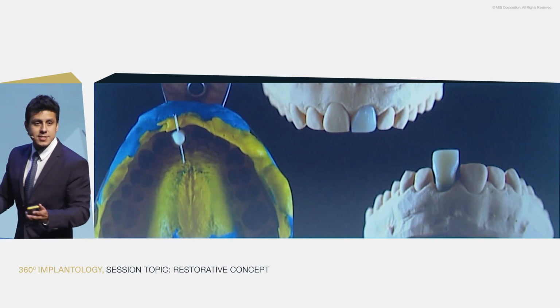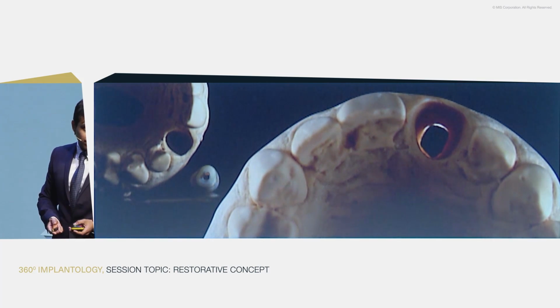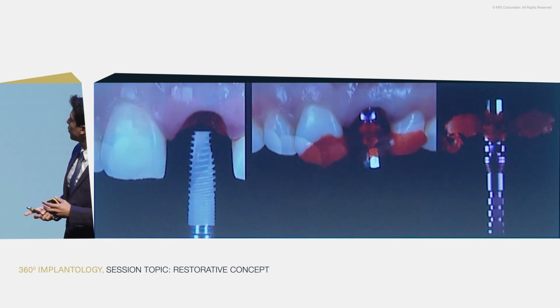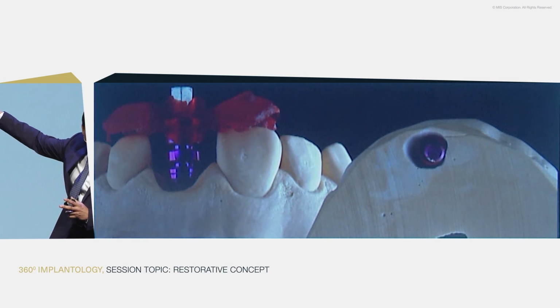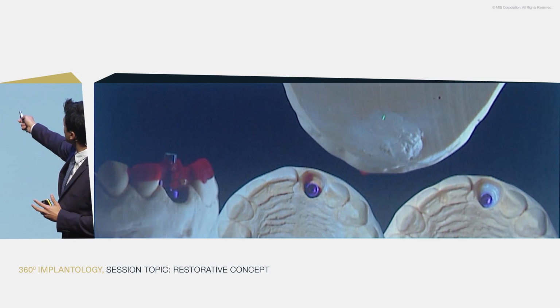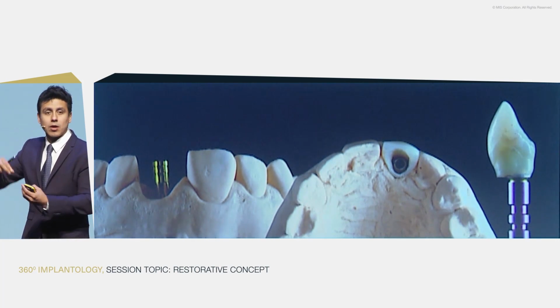After this, we will pour one cast, okay? And after we pour the cast, we have this kind of alveolar model that reproduces the same thing as in the mouth. After this, we will place the implant, and we will create a jig with 2 wings. This jig provides more accuracy and fits our coping tray abutment in the model that we created before. And after this, we will stabilize the implant with some stone in the bottom and some flowable in the top. We will have our natural crown, and we will cut it and place the provisional abutment on top.